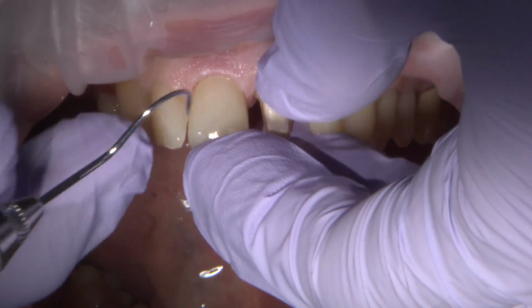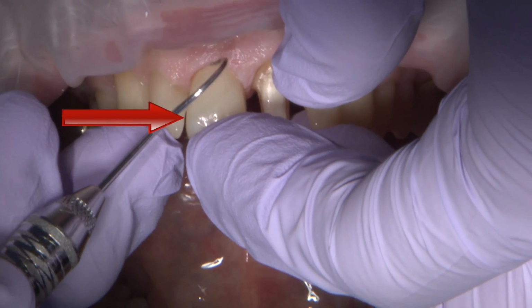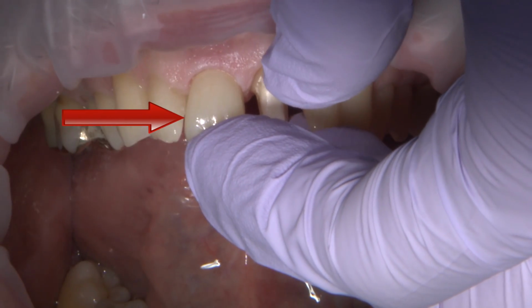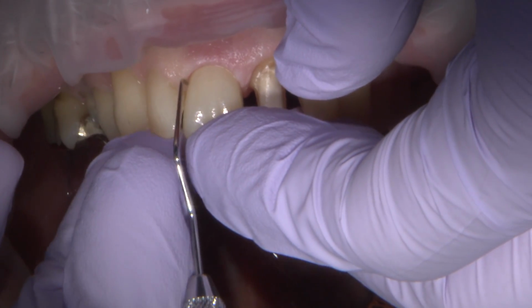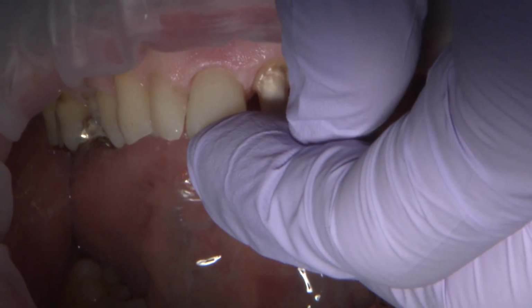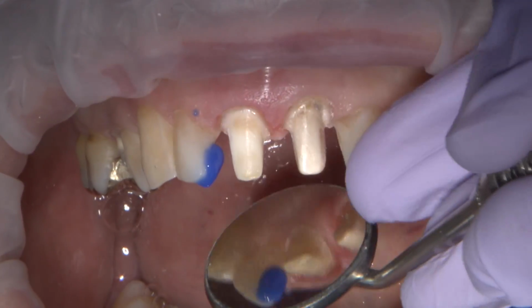When number 8 is in position, there's a little bit of a space between 7 and 8 due to the rotation of number 7. To minimize this space, I decide to place a thin layer of composite on the mesial lingual area with Camouflage Universal A3.